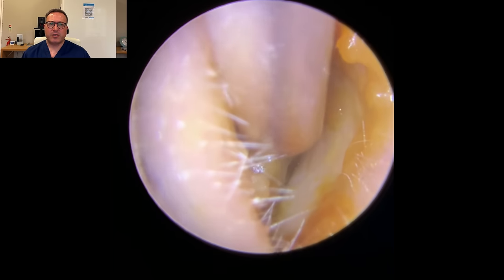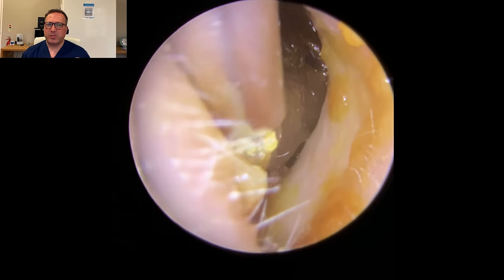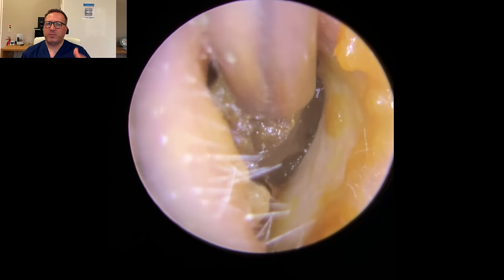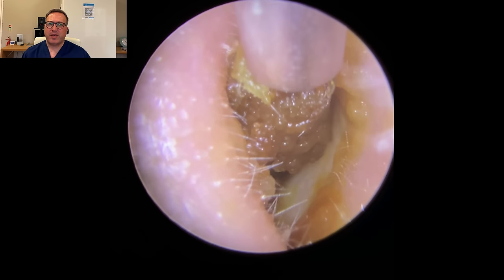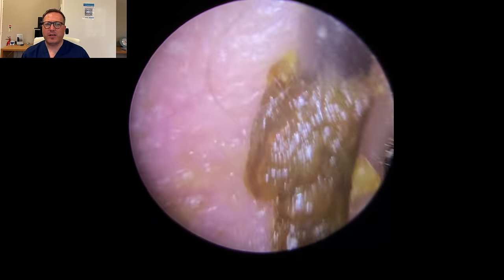We've got the standard size Zolna tube in here now. You can see the front end of the wax looks nice and soft - that's where drops have been used just to soften this up a little bit, so a little bit of olive oil has gone in here. You can see a lot of the softer material getting sucked inside the machine. We're just wiggling this front end to break this away. You can see that whole front section of the wax has come away.